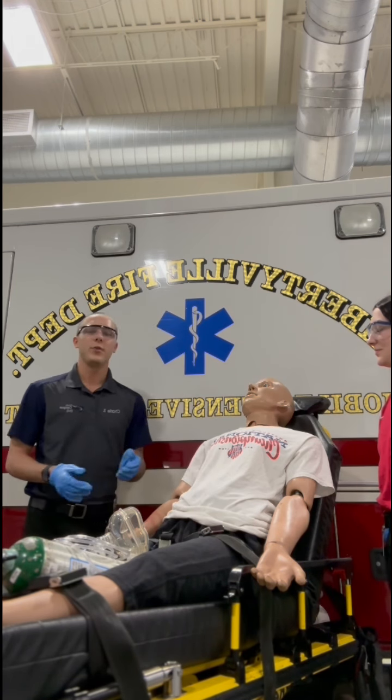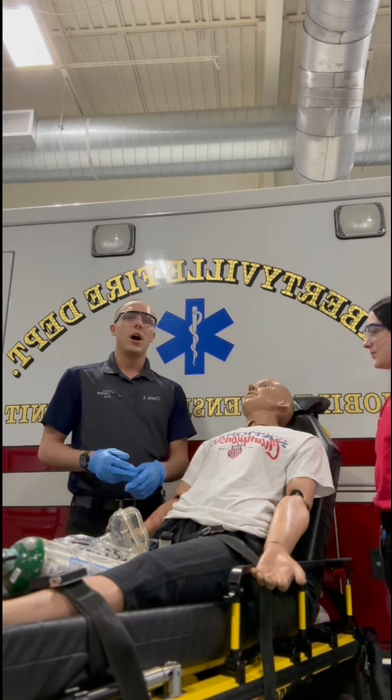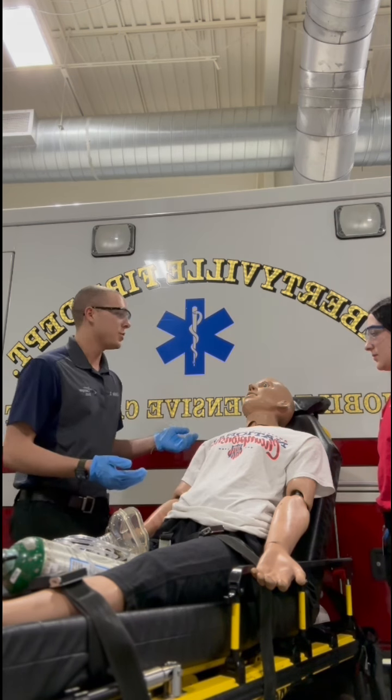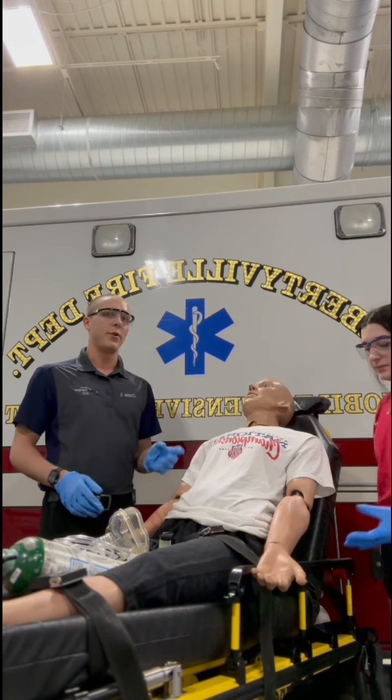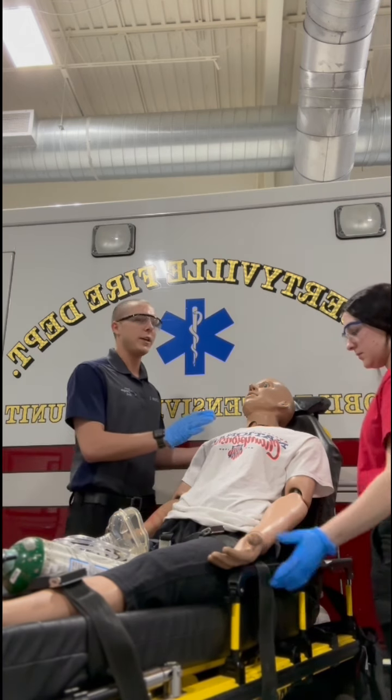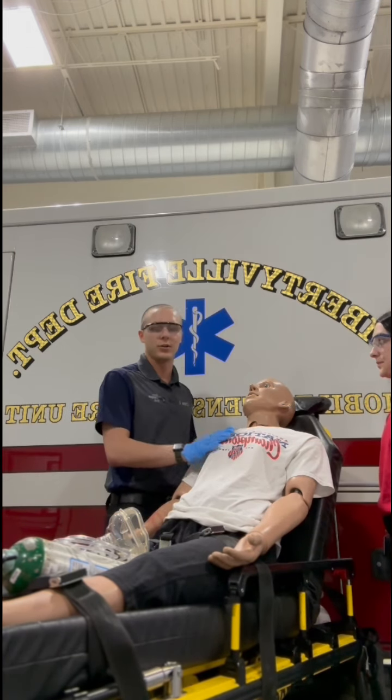So now that we've gone through the indications and contraindications, let's go through the procedure. First, we're going to get a full set of vitals, especially a BP, like stated before, because that's a big contraindication, and making sure our patient is in Fowler's to semi-Fowler's. Now that we've gone through our vitals and positioning, let's assemble the equipment.